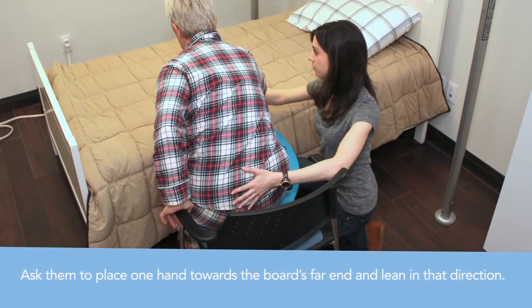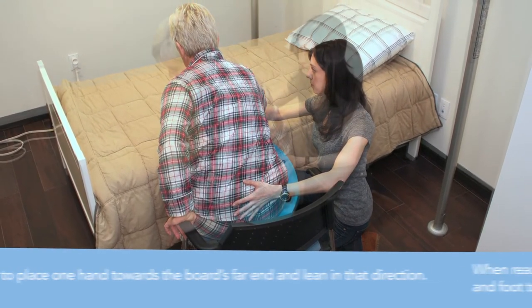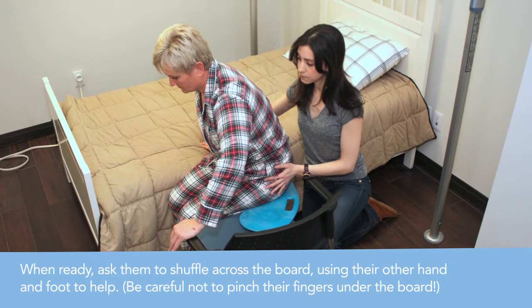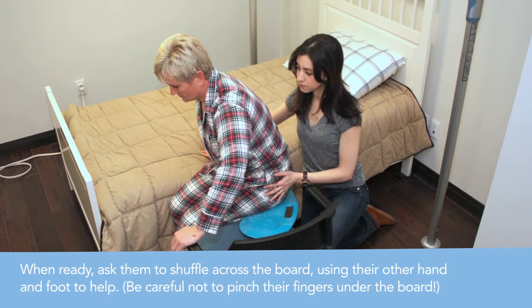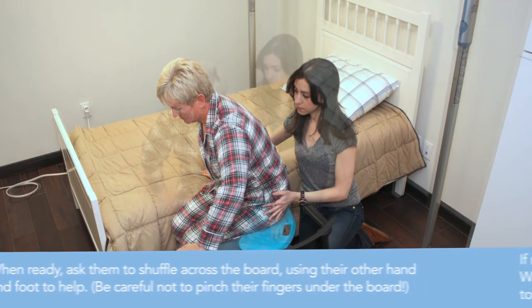Ask the person to place one hand towards the board's far end and then lean forward in that direction. When ready, ask the person to shuffle across the board, using their other hand and foot to help. Be careful not to pinch their fingers under the board.